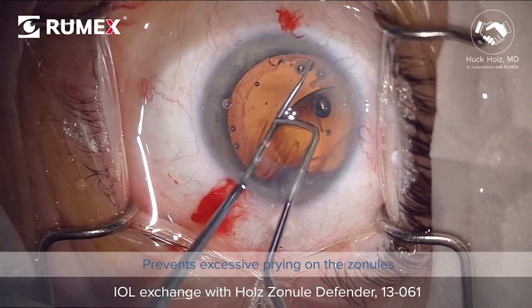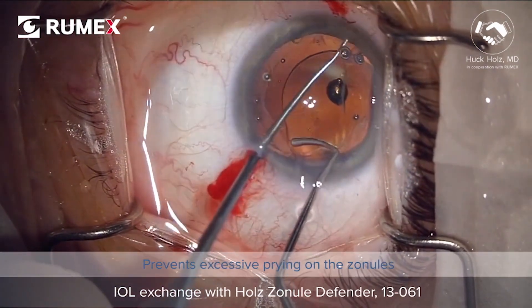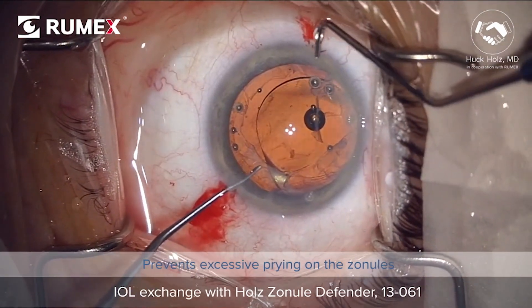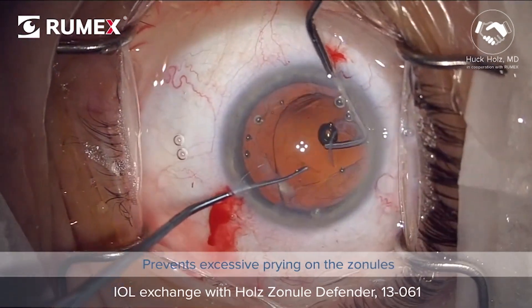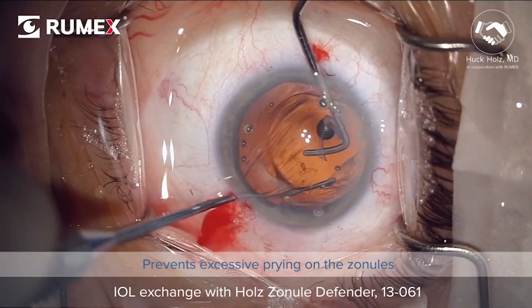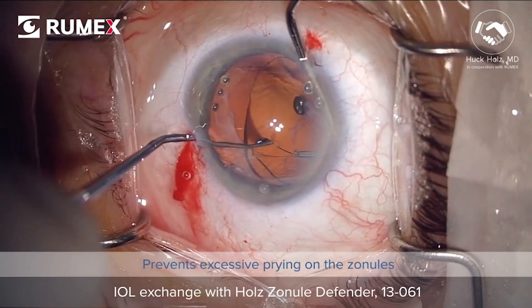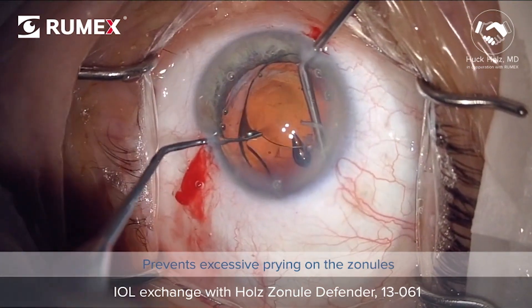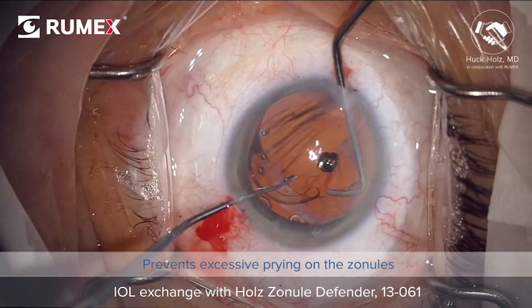The other haptic is then pried free in turn, using the same device through a paracentesis. As you can see, the rounded end of the haptic is pulled gently from the capsule bag without excessive trauma.